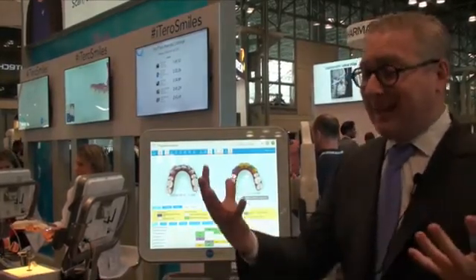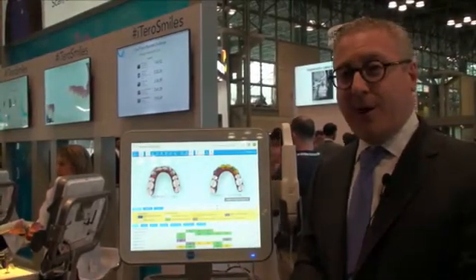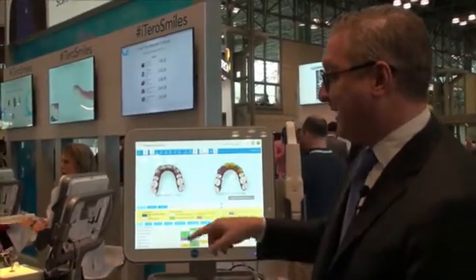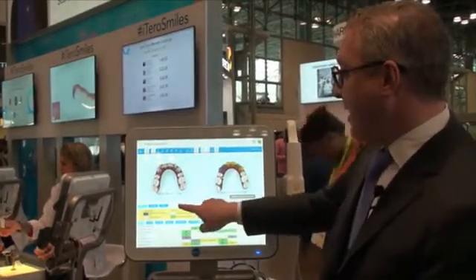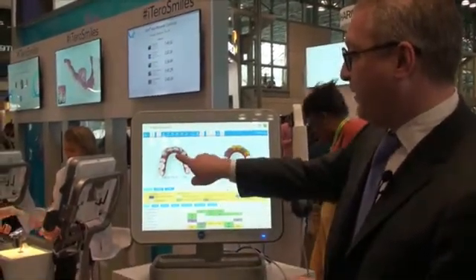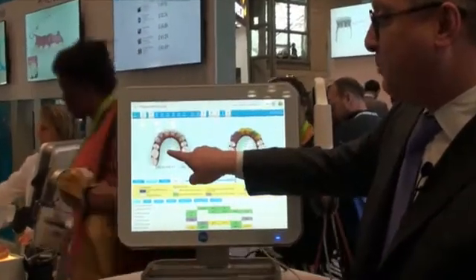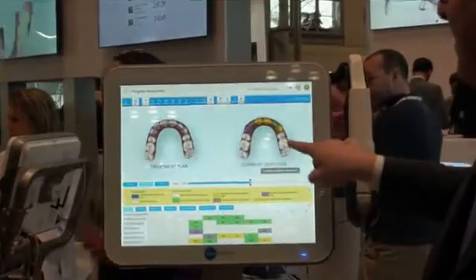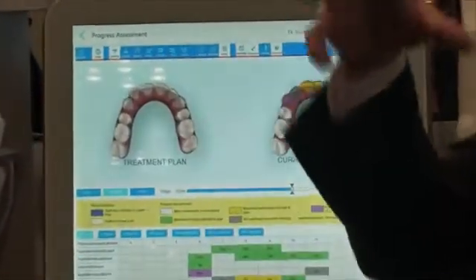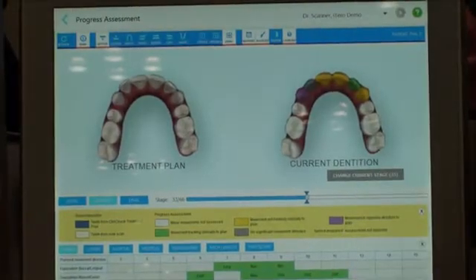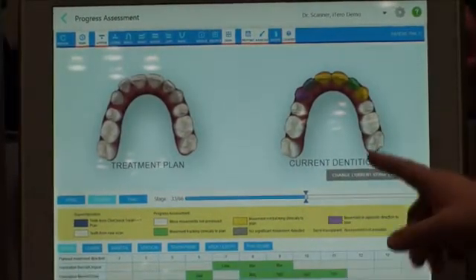Back in the day, you just had to eyeball it — look at the patient, look at the ClinCheck, and figure out where they were. Now we have the Progress Assessment. You scan the patient at about halfway through the treatment. This is what the teeth started at, and this is what they're supposed to look like. The scanner takes your current scan, overlays it with the ClinCheck at that stage, and tells you yes, you're on, or no, you're not.